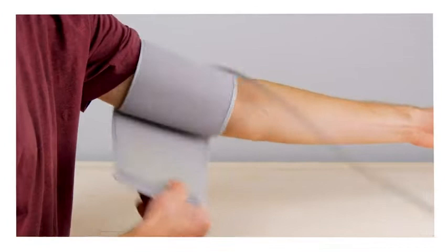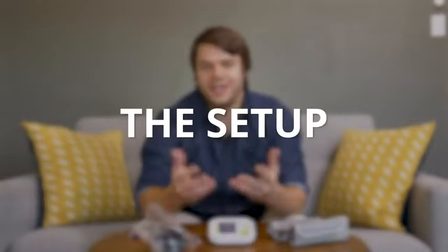That sturdy cuff is going to fit eight and three-quarters inches up to sixteen and a half inches circumference around your arm. And built into this unit is a two-year warranty, just making sure that you're covered and you feel good about your purchase.